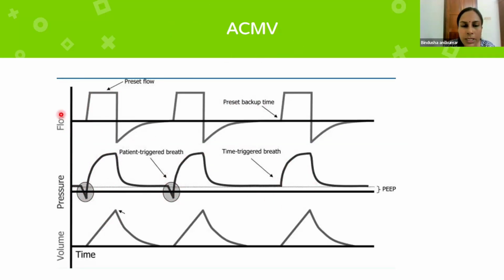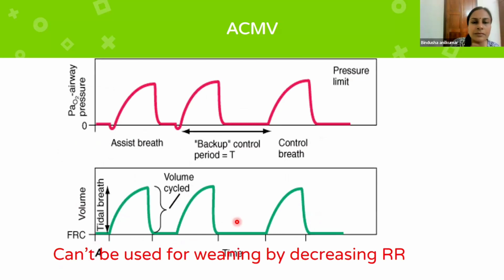But you can see that all the breaths are looking similar, and the tidal volume delivered for all the breaths is the same. The inspiratory time of all the breaths is the same. Okay, so everything will look similar. Okay. So this is the ACMV.